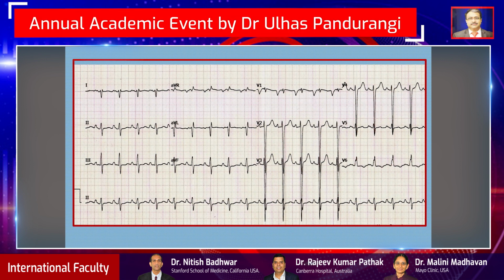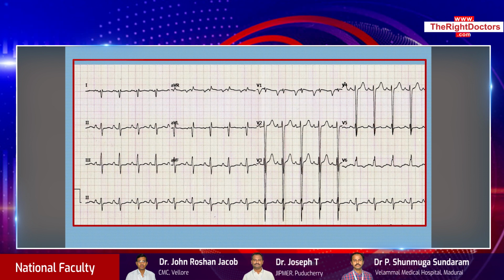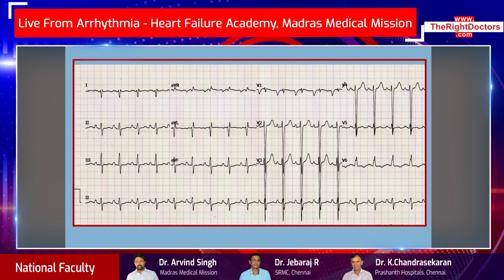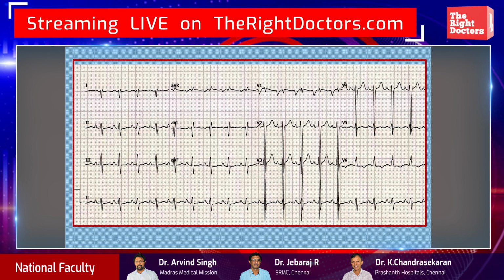Whatever signs he used, but later I found out, yes, dilated cardiomyopathy does cause a lot of changes in the ECG. You have intraventricular conduction delays, you have QRS changes, low voltage complexes. You can even have discrepancy in the low voltage complexes, QS pseudo-infarction patterns, STT changes, and so many things you can have in dilated cardiomyopathy.